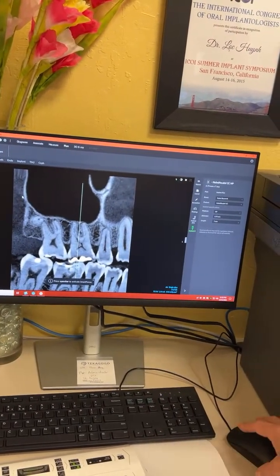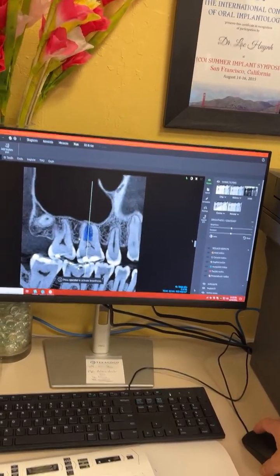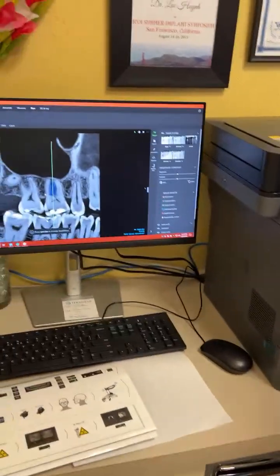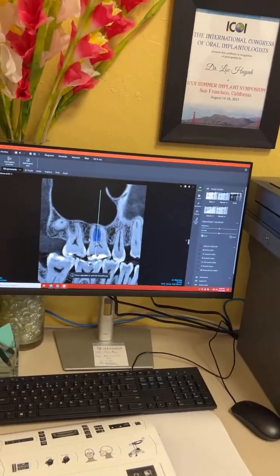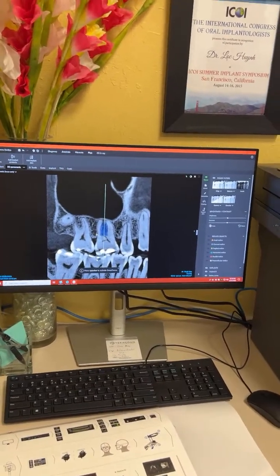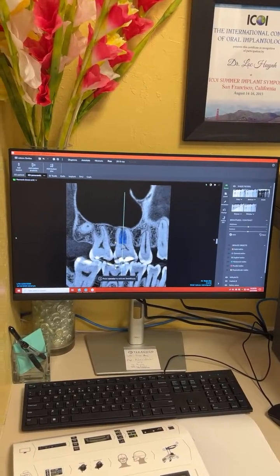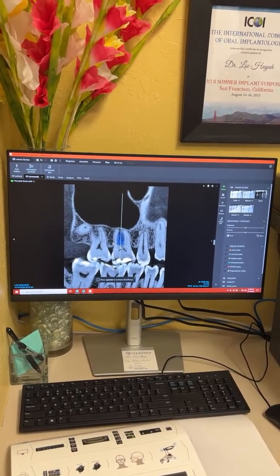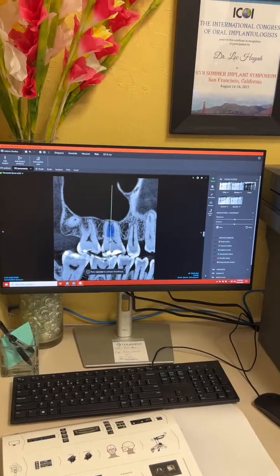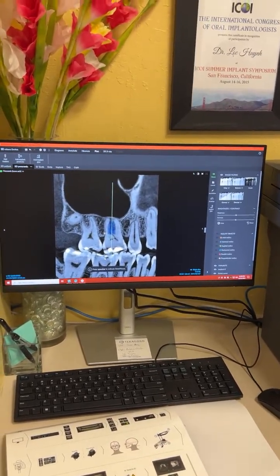So that's training for the doctor. Oh, wait, now this is for staff? It's all training for the doctor, not for you guys. So you'll have another probably 8 hours worth of training because they're not going to need all this. When your trainer comes out, you'll probably spend a half hour just going over difficult patients, positioning tricks, and things that you've maybe had a little bit of struggling with, and they'll go over it with you.